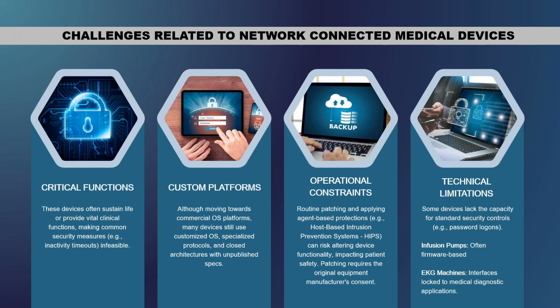But because it's proprietary information, they won't necessarily give it to you. Operational constraints, as you all know, like routine patching and applying agent-based protections, are really good for security, but you can't just have your medical device rebooting on you in the middle of a case while it's on a patient, because that would be really bad. So you have those operational constraints, dealing with your other departments, scheduling the actual patching schedules, and dealing with the manufacturers, making sure you can actually apply the patch.